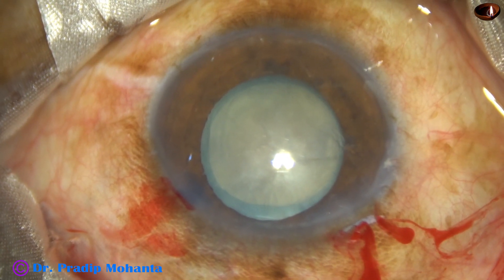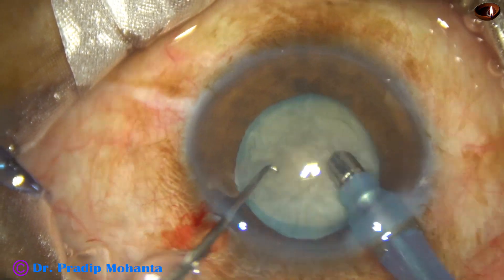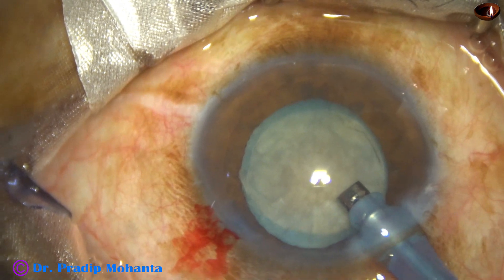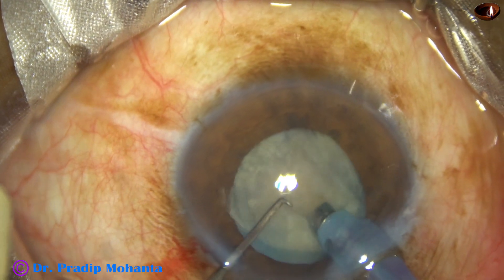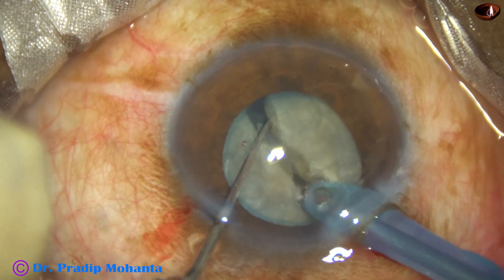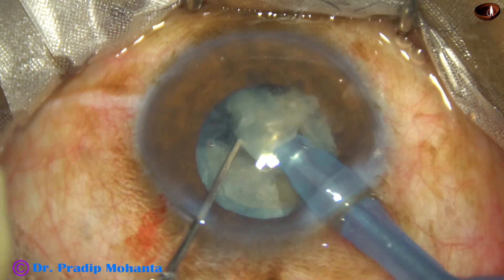Now the phaco needle is introduced. It goes bevel down. Some superficial cortical lens matter is removed. And then the handpiece is turned to make the bevel up towards the cornea. Now the tip of the phaco needle is buried into the substance of the nucleus, going through towards 5 o'clock — this is a nice crack. Now I turn towards 3 o'clock and make another chop.